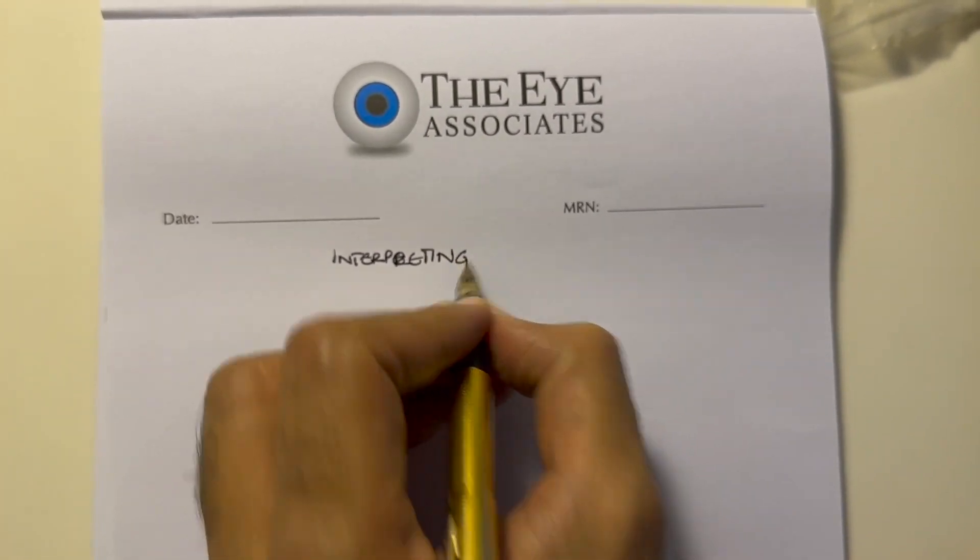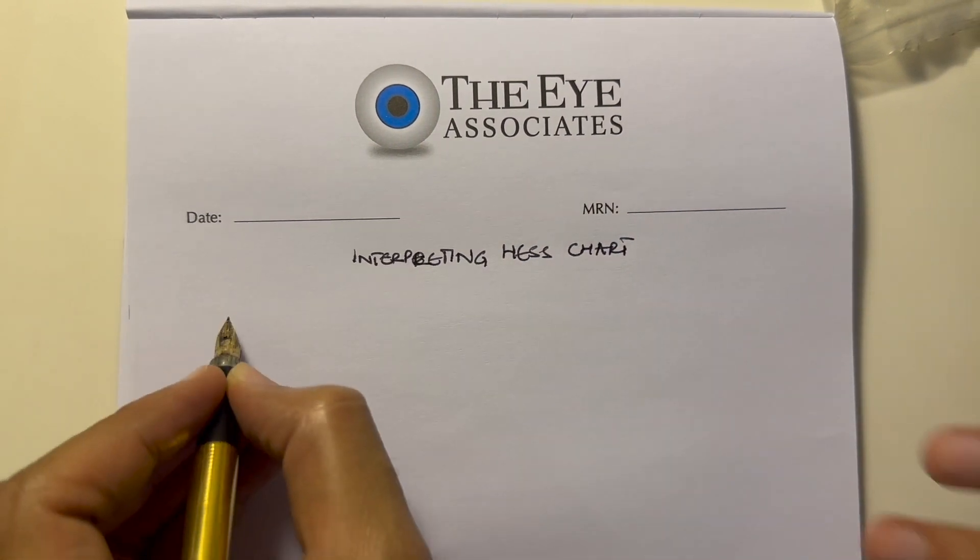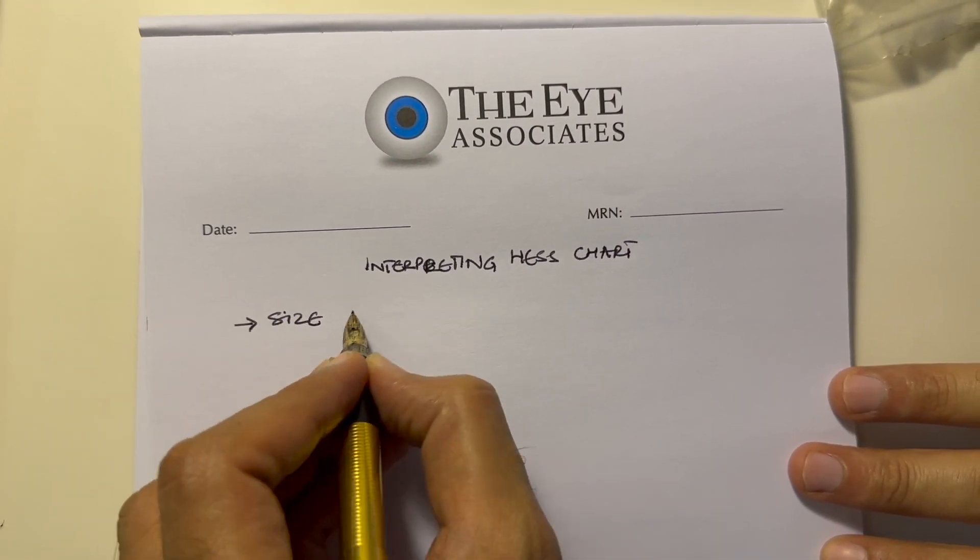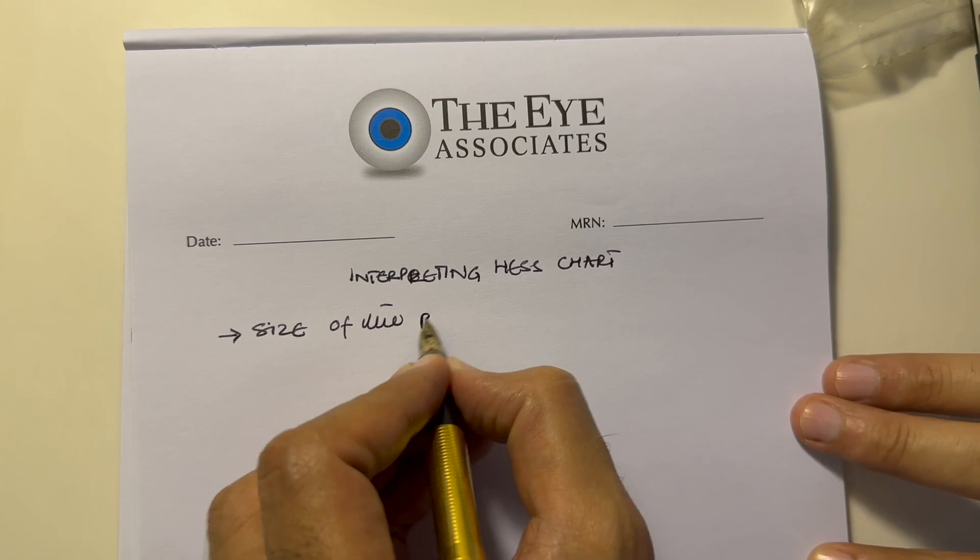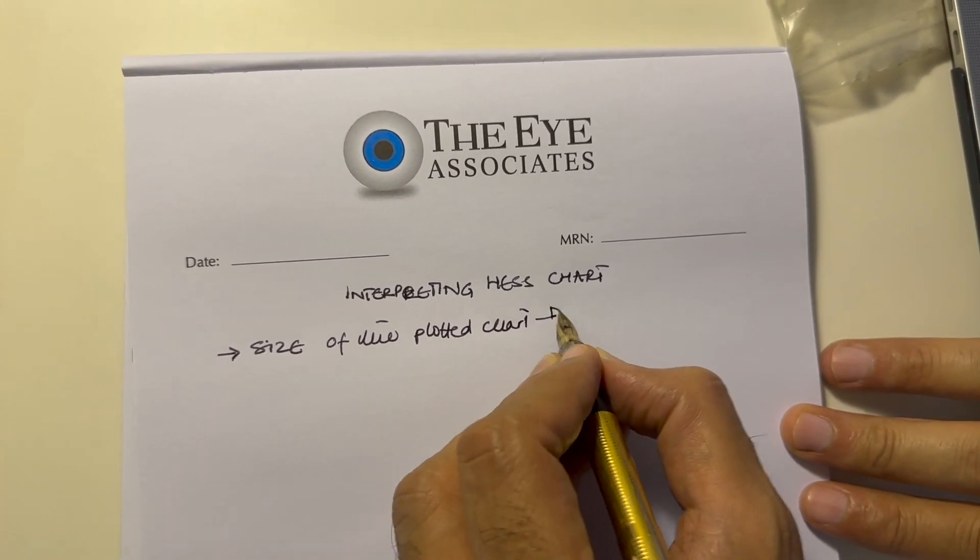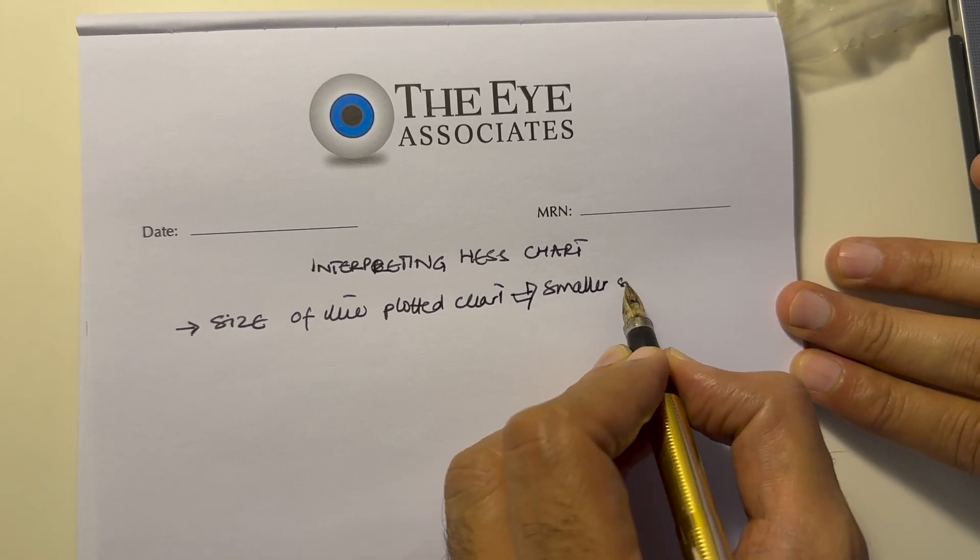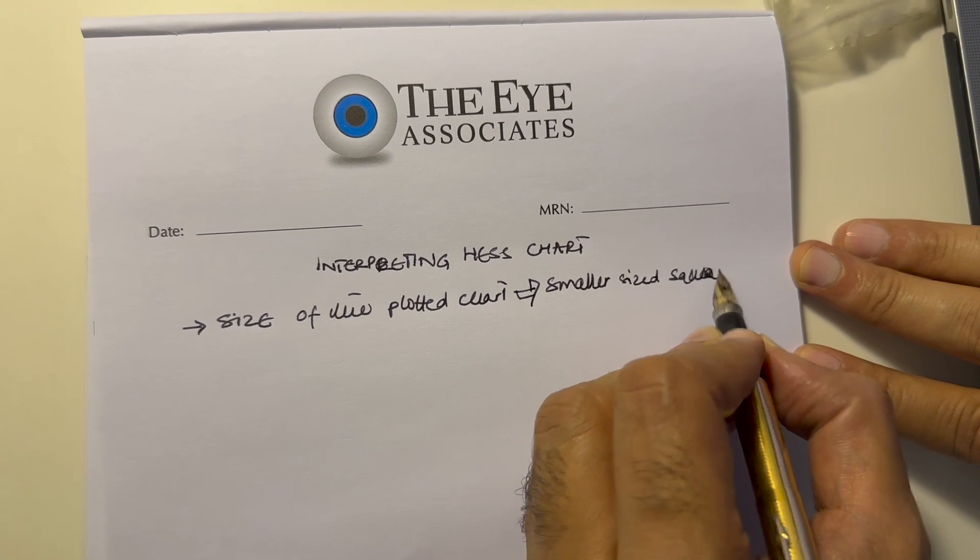The way to interpret the Hess chart is by focusing on a few things. The first thing that you focus on is the size of the plotted chart. Whichever eye will show a smaller sized square, that is the eye which is the diseased or affected eye.